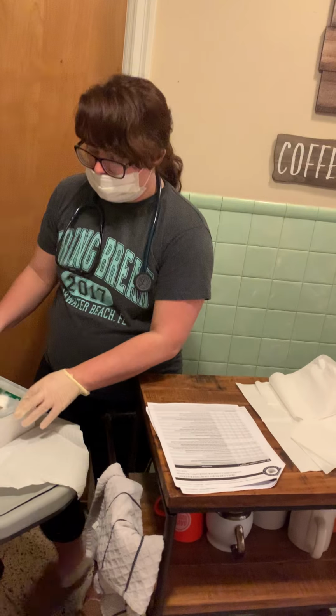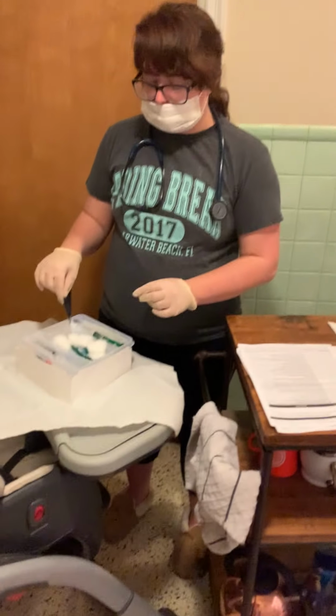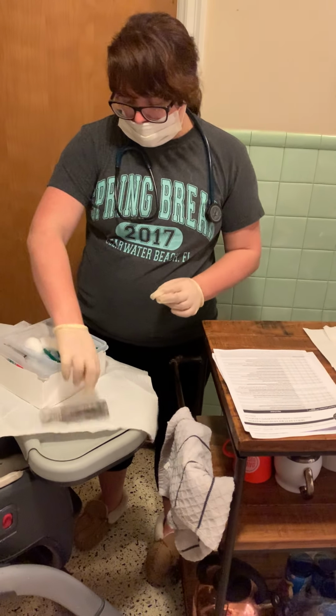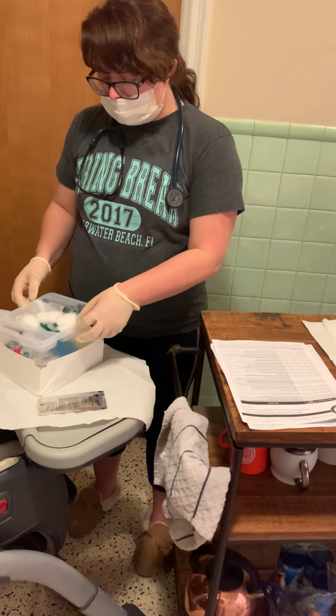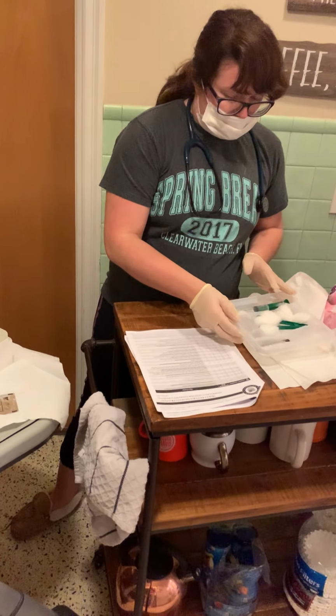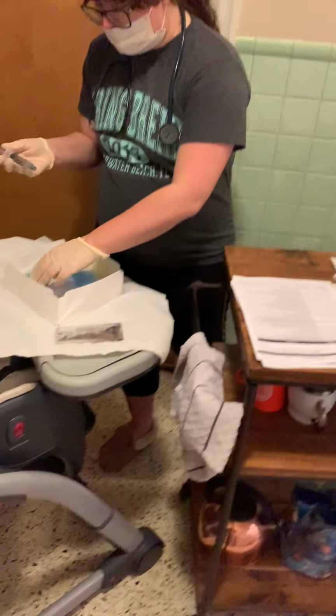I'm going to open the antiseptic, squirt it onto my cotton balls. That's what I'm going to use to clean the perineal area. And then I'm going to move this between my patient's legs. This is going to go attached to the catheter.